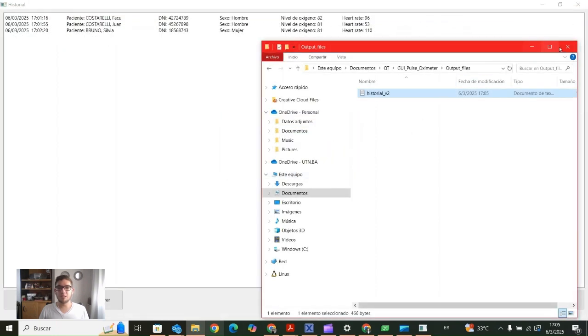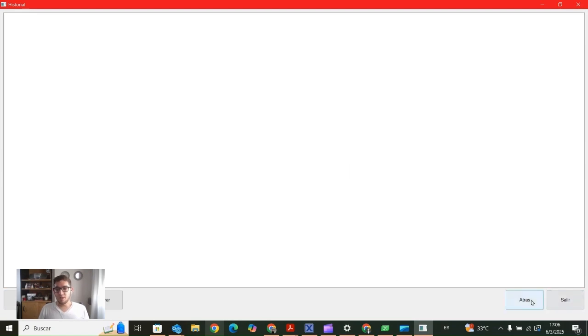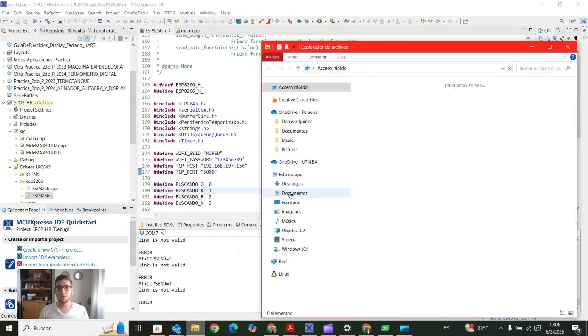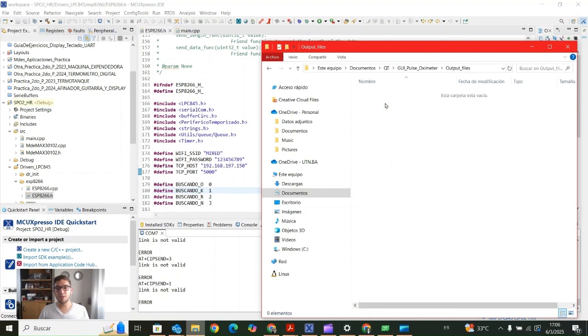Now, if we want to delete everything, so the history has been deleted correctly, and again we can click on exit, for example. Now if we want to check if it really was deleted, we go again to documents, qt, graphic user interface, and output files. So we don't have anymore the .txt file. Okay.